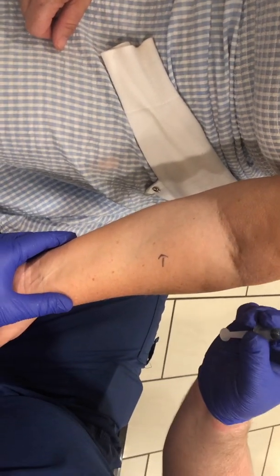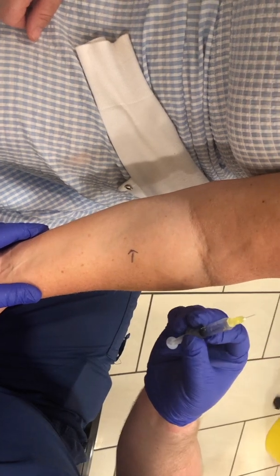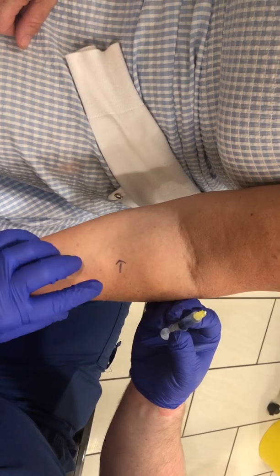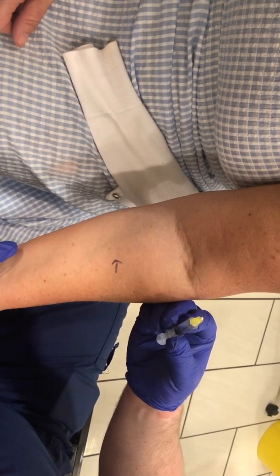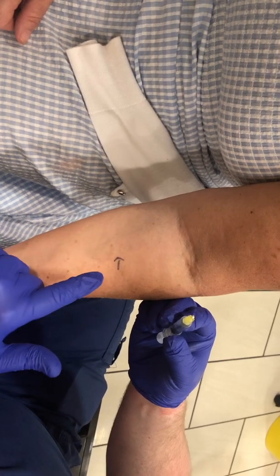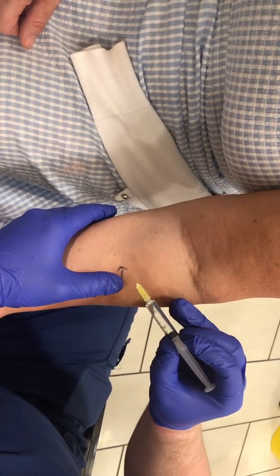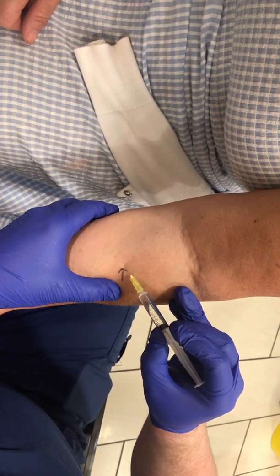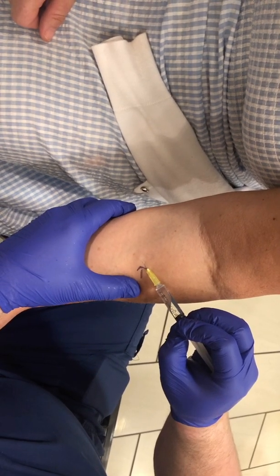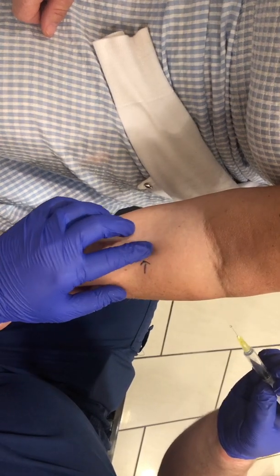What we've got here is a solution of hyaluronidase that I've mixed up — hyaluronidase in 2ml of bacteriostatic saline, popped into a 2ml syringe. I've cleaned the arm first with some surgical spirit and put a little arrow on the arm just to remember where I've put it in. I'm going to make a very small injection just under the surface of the skin and pop through a few units of product.